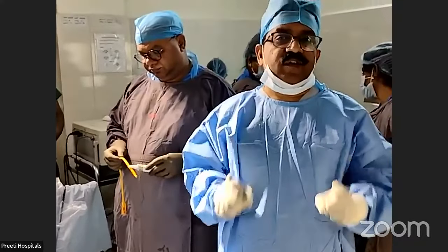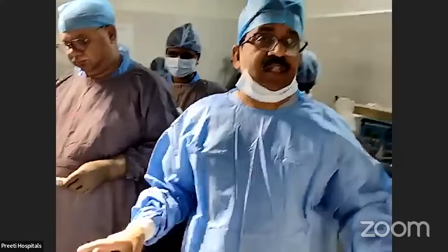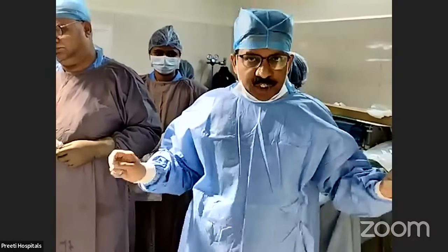So thank you for the opportunity. Once again, don't try to attempt these cases just because we are showing them. We are focusing on the principles and new techniques, but not the surgery per se. This is the principle of surgery. If the ureter is not dilated, don't put the sheath.